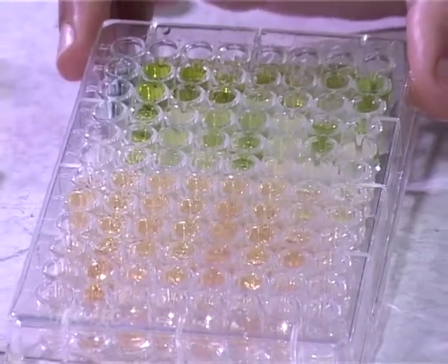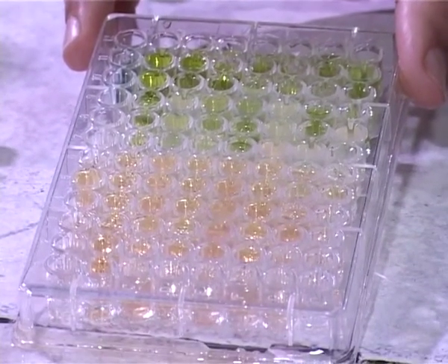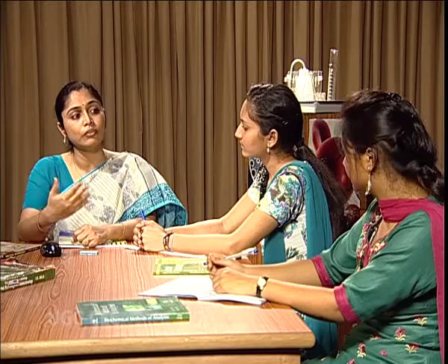Clear? Then we have to see the coloration. Now can you tell me why we are washing the wells after each addition? Yes, ma'am. I suppose if excess of antigen will be present in the sample, then it may give a false result. So hence washing is good.